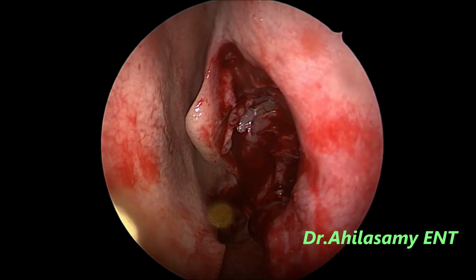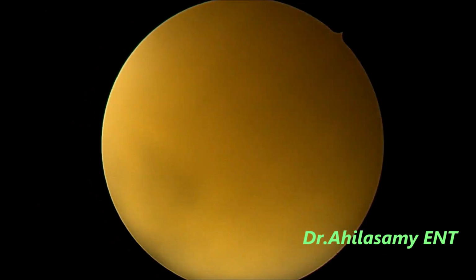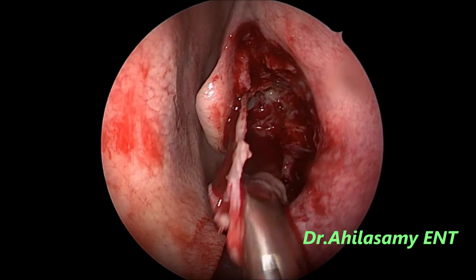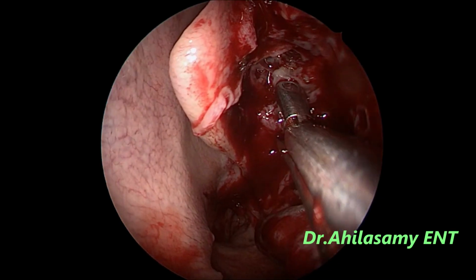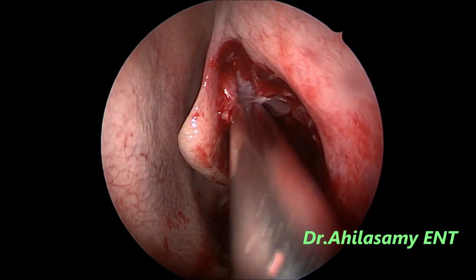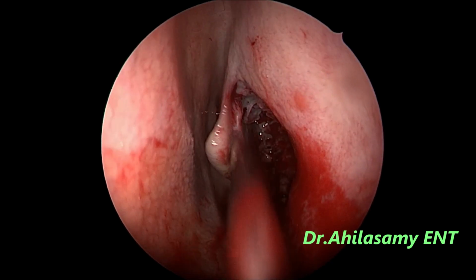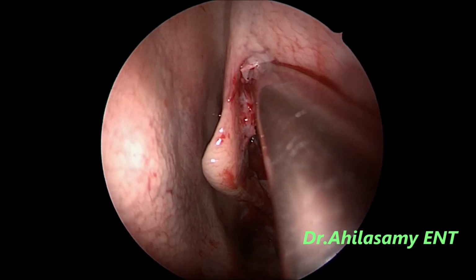Of course, this was done under moderate sedation. We usually use dexmedetomidine with fentanyl. In this case, I used remifentanil with propofol. So I am removing the bulla with the Blakesley forceps. Of course, you can use a shaver, but the bone bits get trapped and block the shaver frequently. After removing the bulk of the uncinate, I am using the shaver, the same shaver.